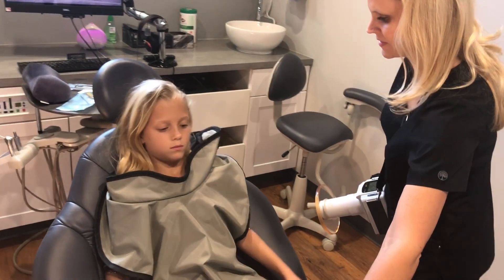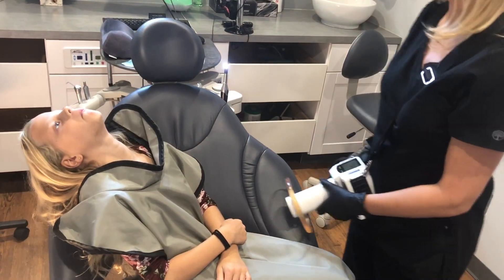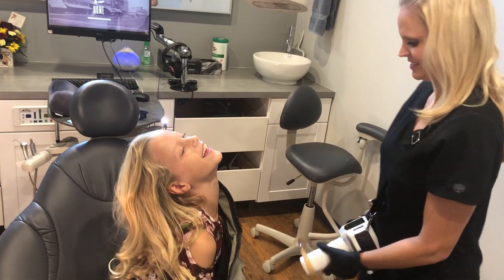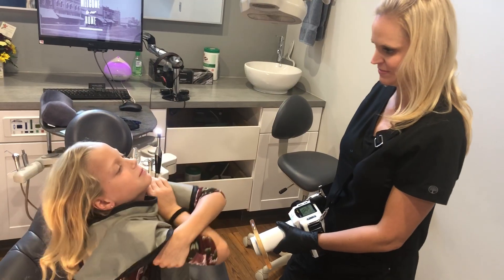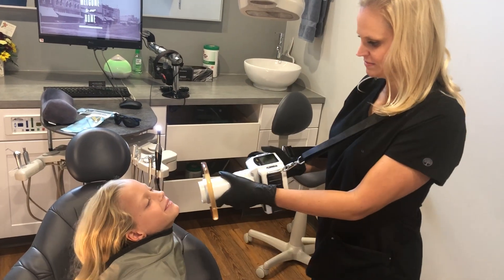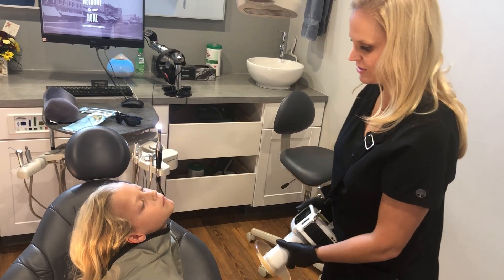And the main thing here is the anterior, so move over to the anterior positioning. Okay Kayla, I'm going to have you look up — sit up nice and tall. And look up. That would be for the next anterior shot. Nice anterior positioning.